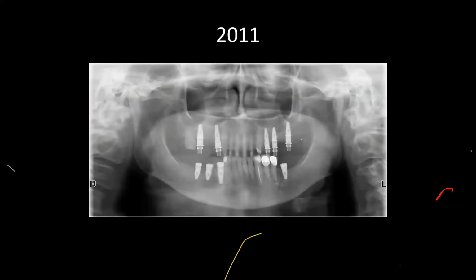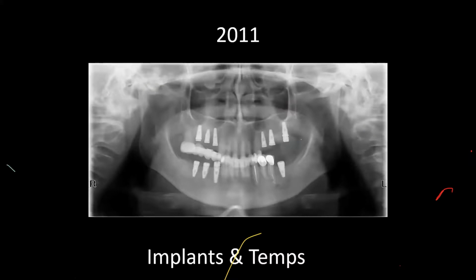We're going to go through some of the x-rays. This is 2011, and again temporary bridgework, provisional bridgework, is in situ. At this time, we use a provisional bridgework to increase the occlusal vertical dimension to an ideal smile line and an ideal maxillary plane, and that's determined clinically, not by the articulator, because that gives you a more realistic picture. That's very important to understand. The articulator is one thing, and that's a very good comment that was made earlier, but it doesn't tell you much information.